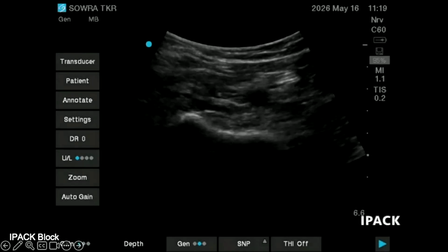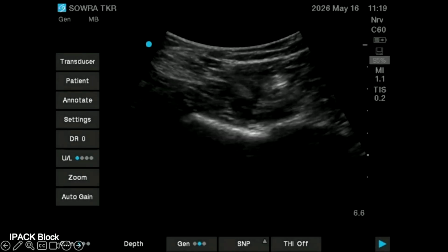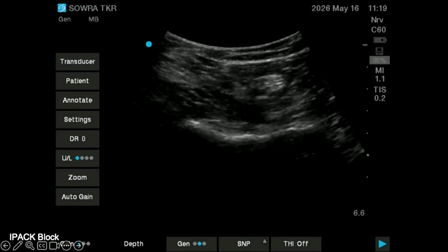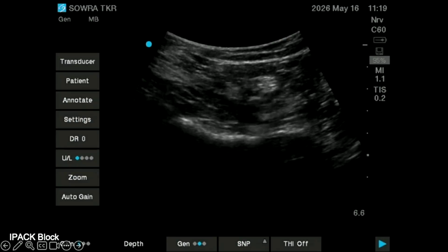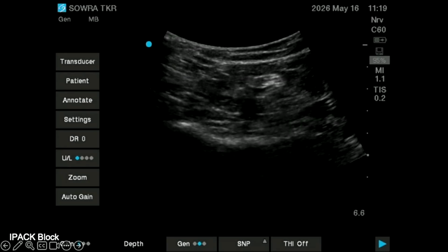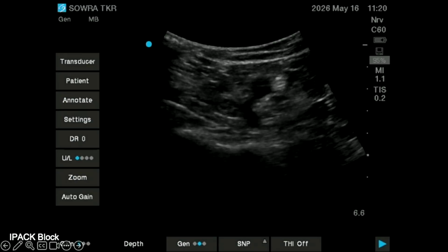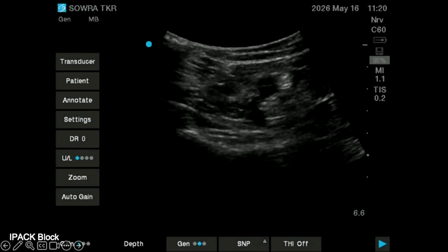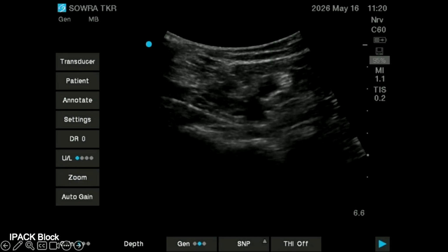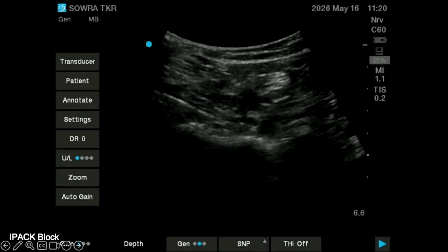the similar kind of scenario, we're rocking in to look at the knee condyles, coming back to a point where it flattens off. You can just see a very bright tibial nerve above that sort of dark pulsatile vessel, and then my needle is coming in, I think from the left. There we go, needle's coming in now, and a relatively horizontal needle trajectory. I seem to remember this was quite a challenging one to do.